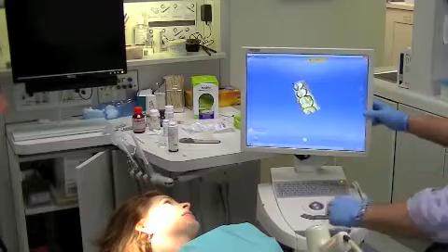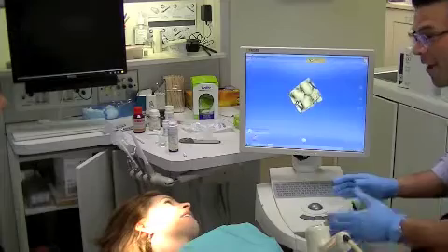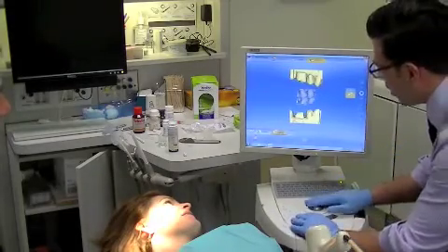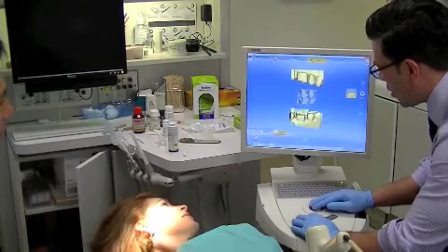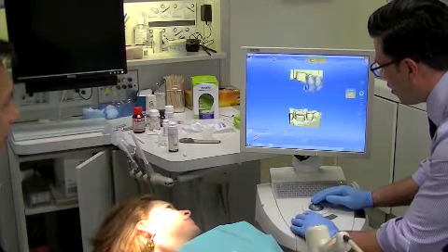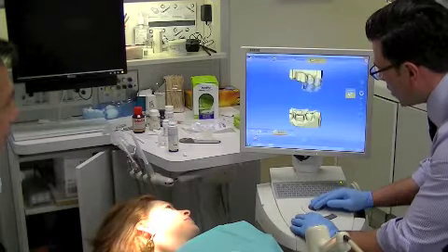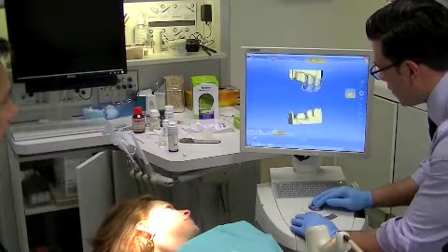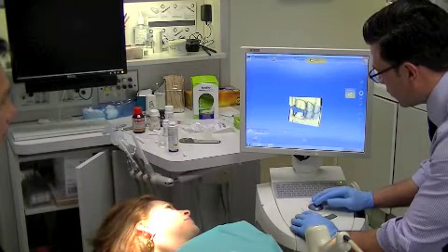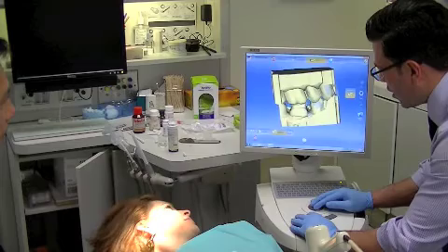We'll just keep videotaping this so we can show them how to do it. Now, one thing — every patient, look at where her head goes. They love this. Now what we're going to do is take a look at that and match this to here, put it to there, and get it into the same plane.